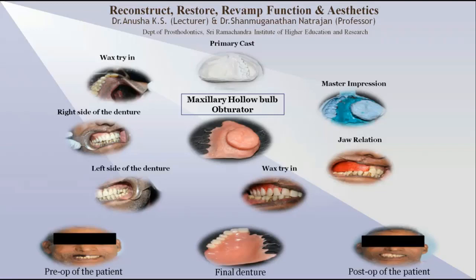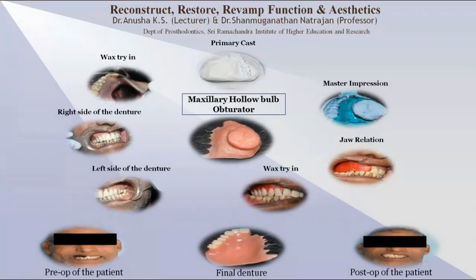The patient was finally recalled after 6 months and after a year also, and had no complaints. He was completely happy with the aesthetics, the smile, as well as the function of the denture after a year. Such procedures give a new lease of life for patients who have maxillofacial defects and help them to overcome the social stigma created by our society.